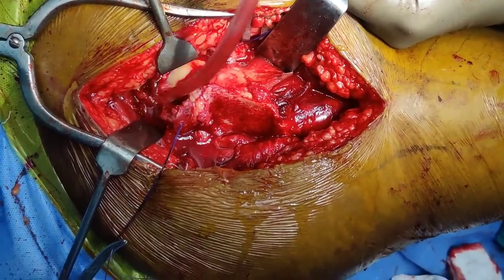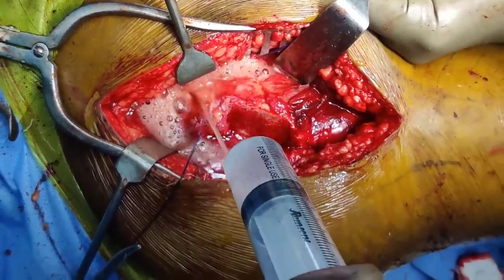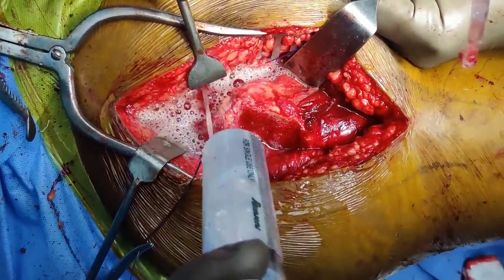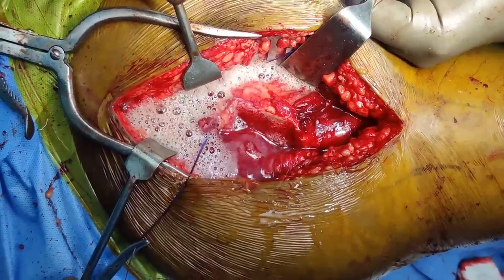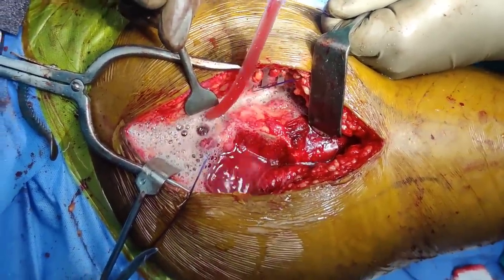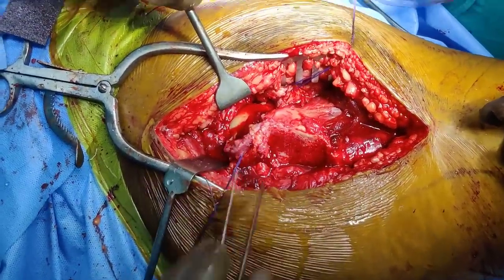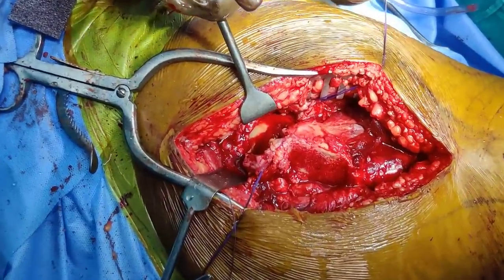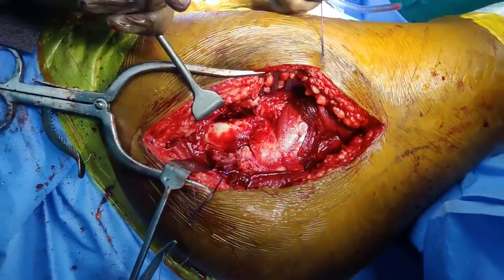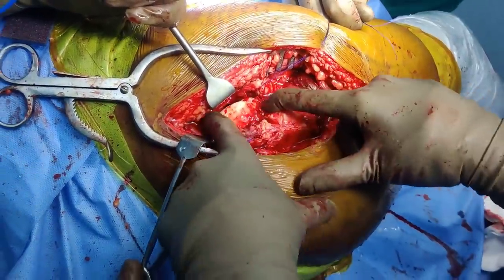If you have got an isolated Pipkin type fracture, all you need is to dislocate it and fix it with a Herbert screw. However, if you have a posterior wall fracture or posterior superior wall fracture as in this case, you need to address the intraarticular fragment first, fix the head, and then proceed with your posterior fixation. You can see the labrum, the capsule, and the femoral head. Now if we externally rotate the head and put it in the figure-of-four position, we should be able to get the head out.